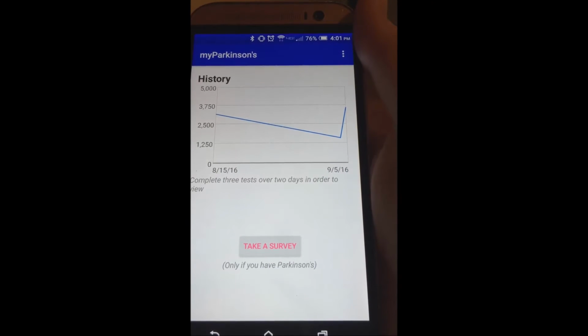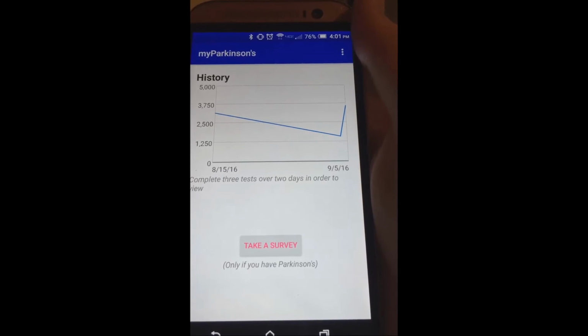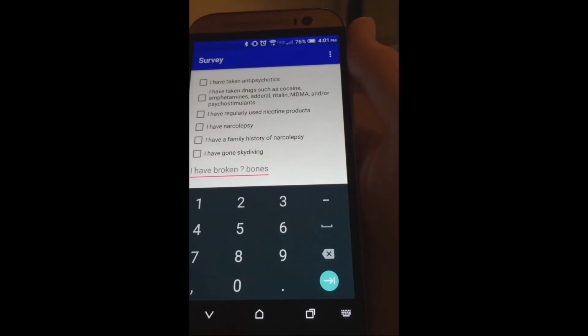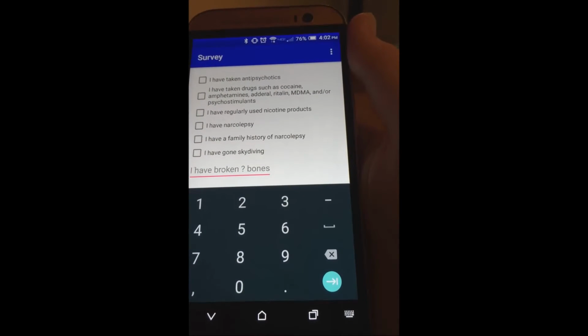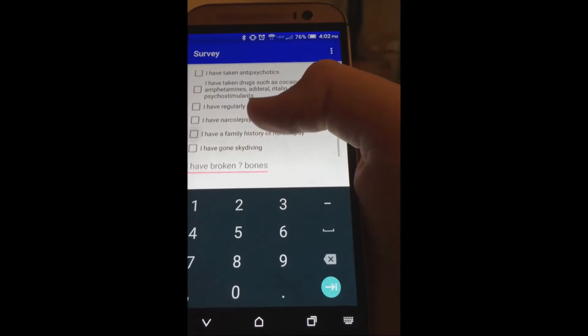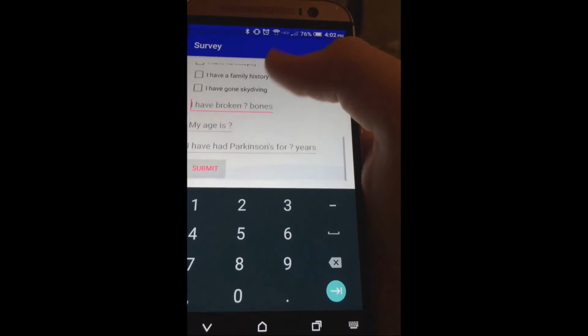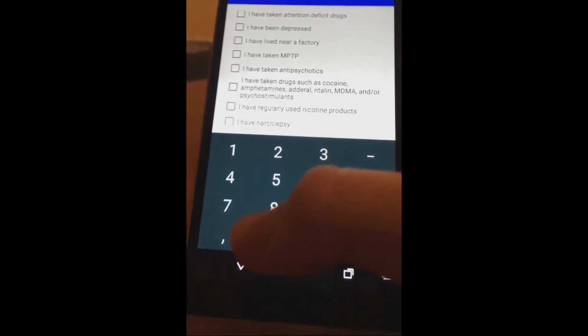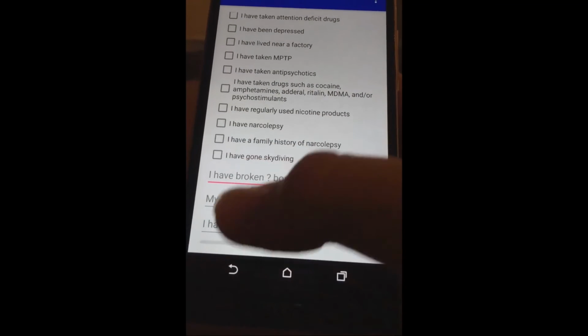In addition, tremor data can be paired with user survey data, again connected to each user's internal ID, to potentially find out more about Parkinson's disease. Specifically, the questions relate to the causes of Parkinson's disease, how age and time affect diagnosis, and family history. So, this allows for more in-depth Parkinson's research. I put a lot of consideration into what the questions were and researched Parkinson's heavily before coming up with them. So hopefully there will be a correlation between one or more of these questions and a trend in measurements.